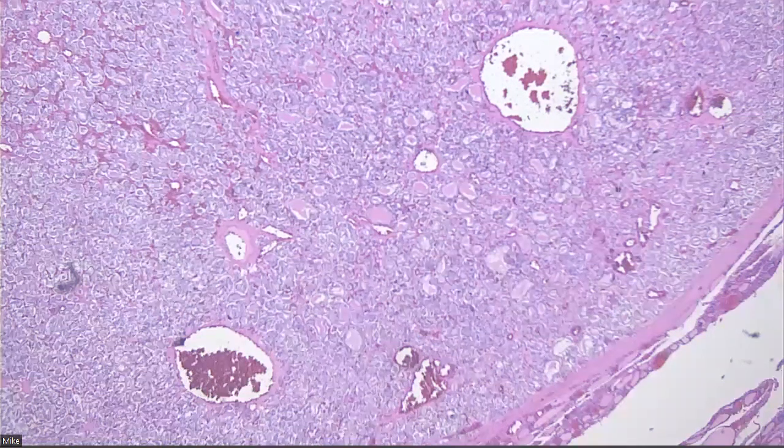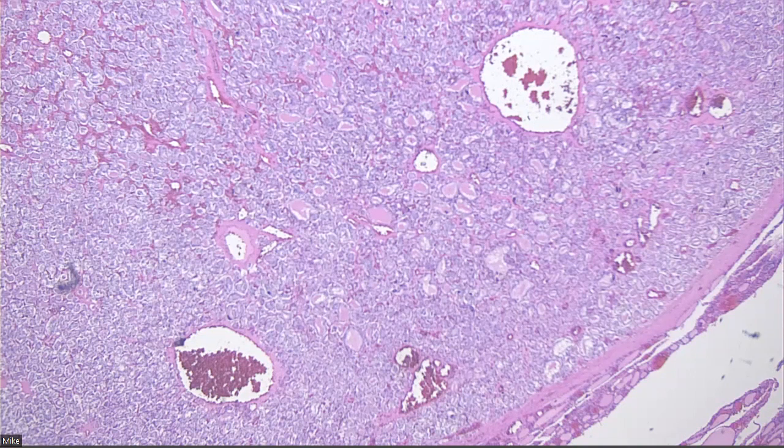I guess that's something we have to keep in mind when we gross as well, right? Odd number of nodules, dominant, how they describe it. Exactly, and thank you for that. When you guys are grossing, it's really helpful to know that you made some attempt to find out what they did, and comment on the gross of these things, exactly.